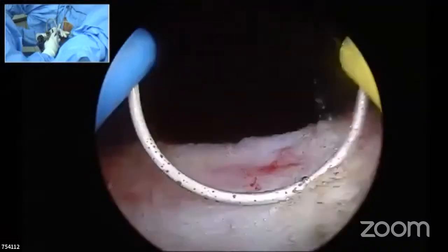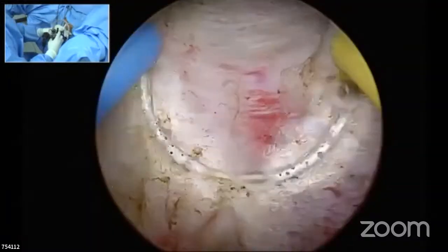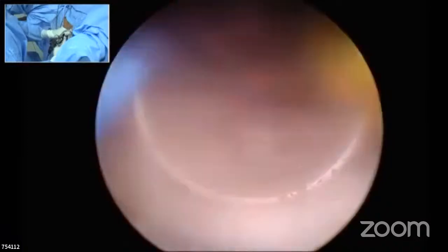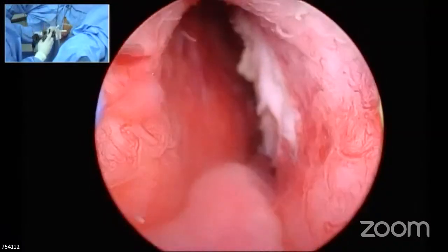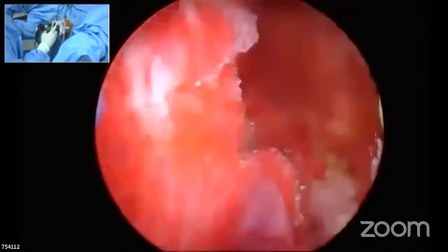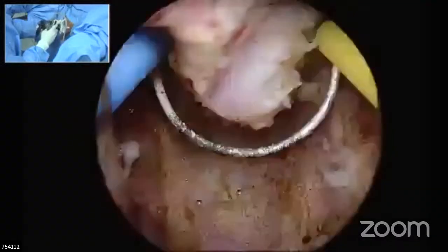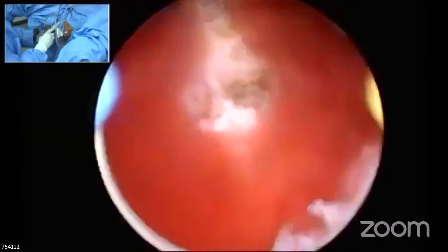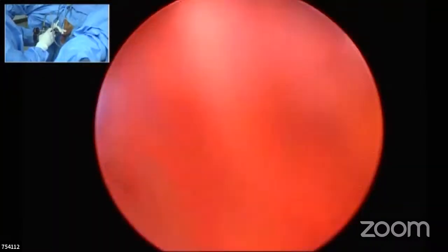One of them was asked, how often do you lubricate the urethra during the procedure? I really don't. I put around 20 cc of xylocaine jelly at the starting point. Later, I don't. But if you are doing a large gland and your resection time is exceeding 30 minutes, at the end of 30 you can ask your assistant to put some jelly at the urethral meatus. That is our practice actually. True, sir.